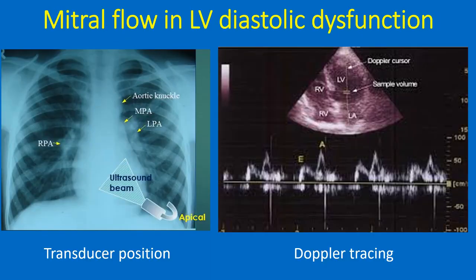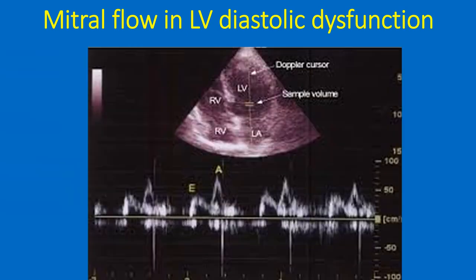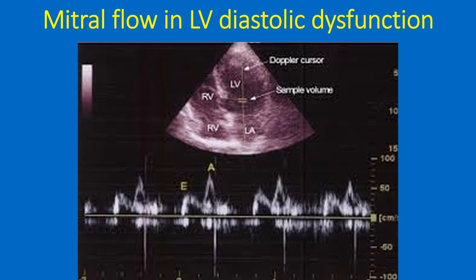Doppler interrogation of the mitral valve is usually done from the apex through the apical 4-chamber view. The transducer is placed directly over the apex beat and the echo beam is directed upwards. A good 4-chamber view of the heart is obtained showing all 4 chambers and both atrioventricular valves. The Doppler cursor is aligned along the long axis of the left ventricle passing through the mitral valve, and the sample volume is placed just distal to the mitral valve to pick up the flow in the left ventricular inflow.